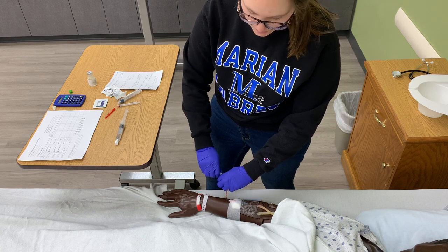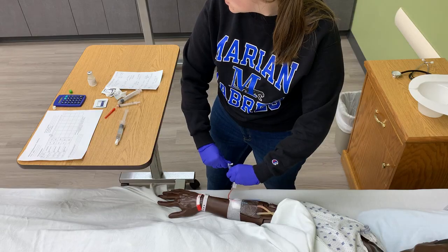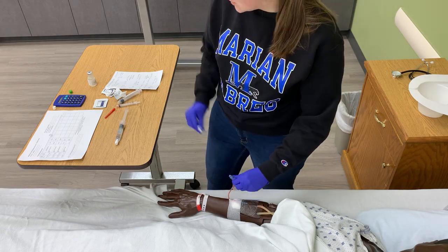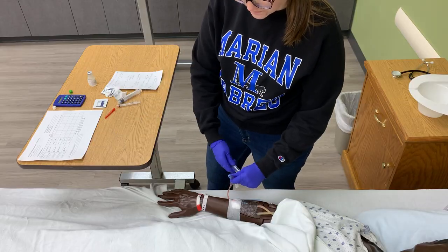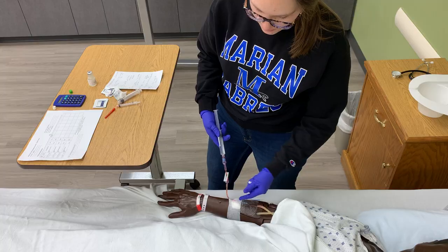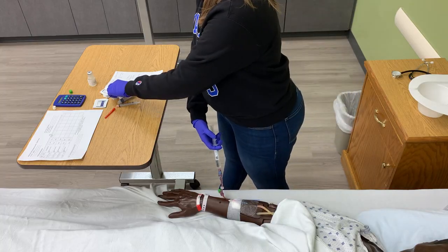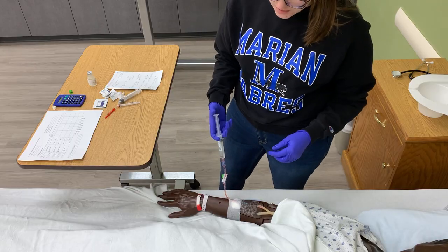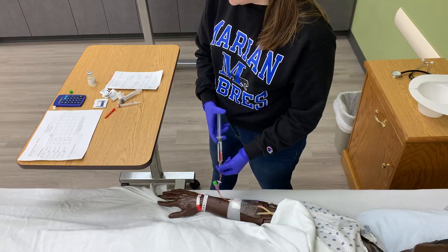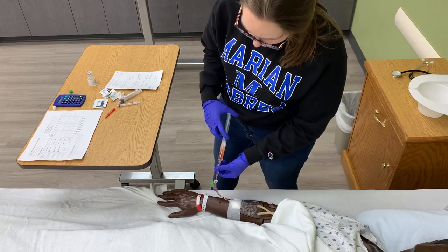So wiping this off for 10 to 15 seconds. Okay, we're going to attach our second flush here. So based on our calculations before, and we can see here we have furosemide still on the IV tubing. So I have to give the first 1.5 mLs at the same rate as the medication. So I'm going to give 1.5 mLs over 2 minutes. So we calculate that out. That's 0.2 mLs every 15 seconds.